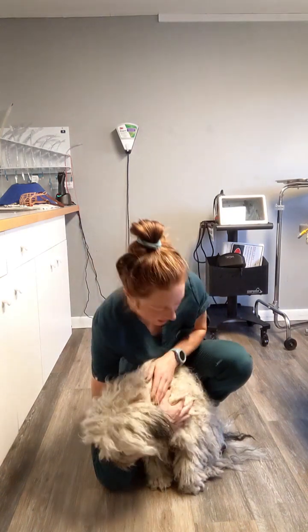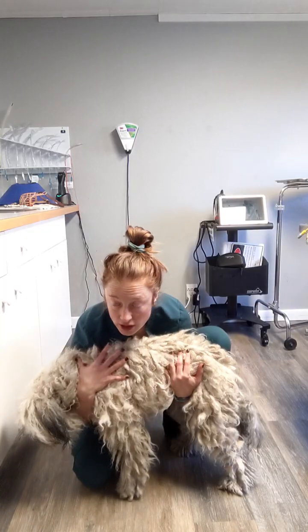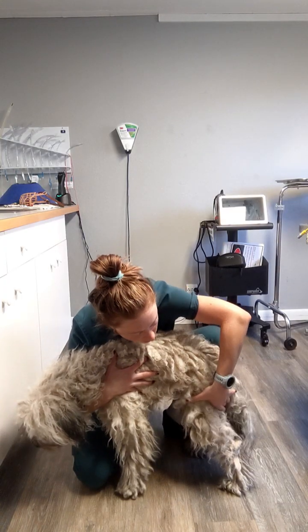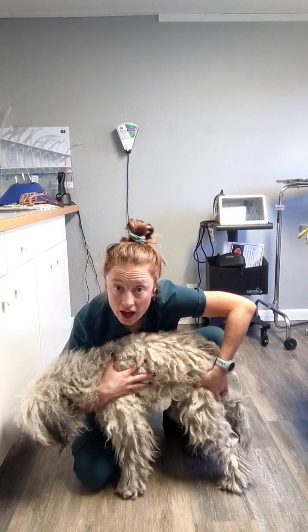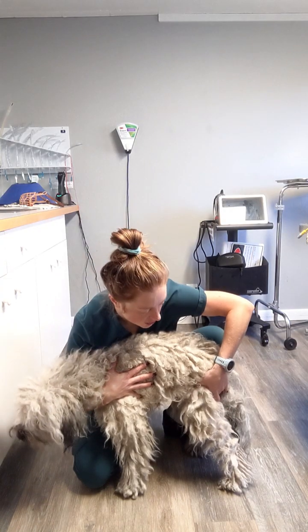And then for a saphenous blood draw, I'd like the patient standing. I've got one hand under the belly and one hand securing the front and the head to make sure that she can't move her head. And then once the tech is ready, I can slide my hand around, and I will just be placing my hand around the back of the thigh and occluding that vein for the saphenous blood draw. And again, holding the patient against my body to make sure she can't wiggle around.